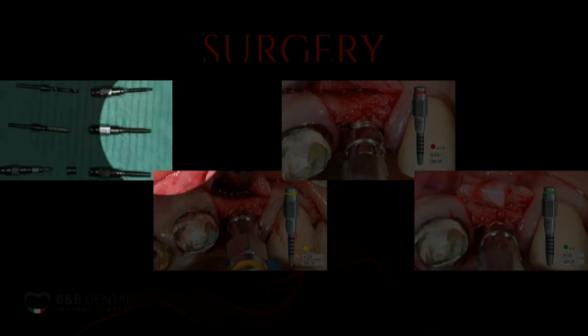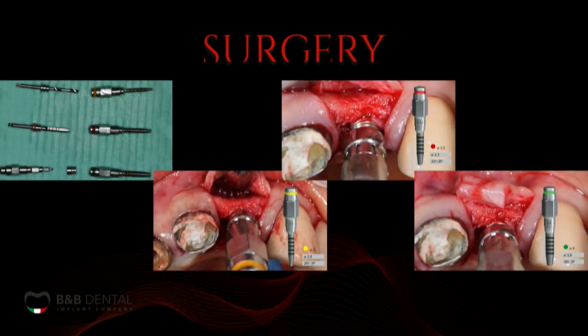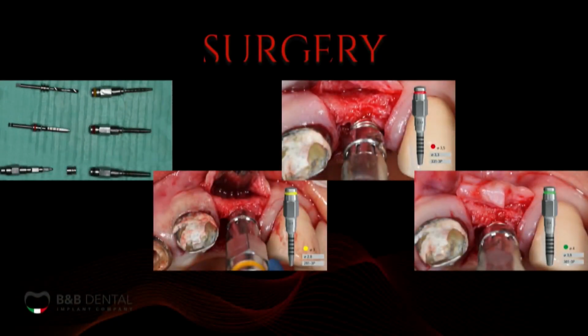We have the drills and the color code, the analog expanders of the B&B Dental system, with one stop, which is the one that we decided for our implant, and that's it. Of course, I prefer to use the condenser, but sometimes we still need the drills, the burrs, to correct the direction of the implant, maybe if we want to go a little bit palatal, for example.